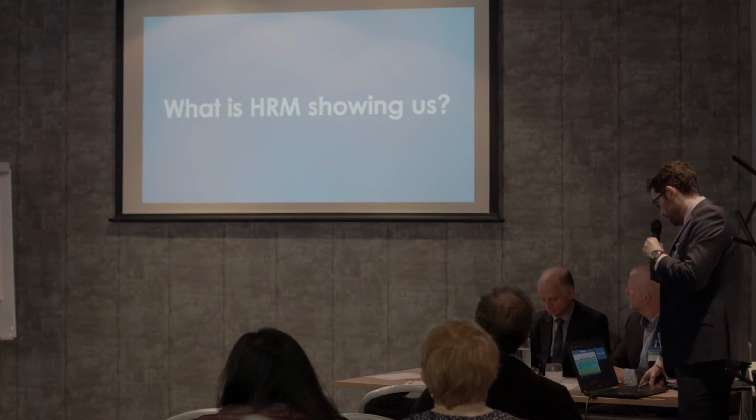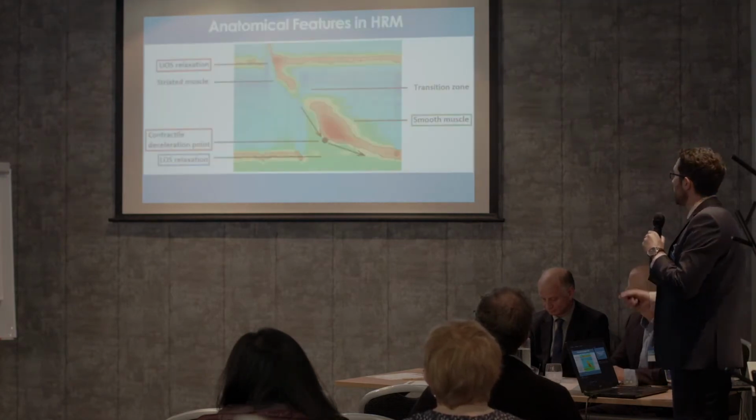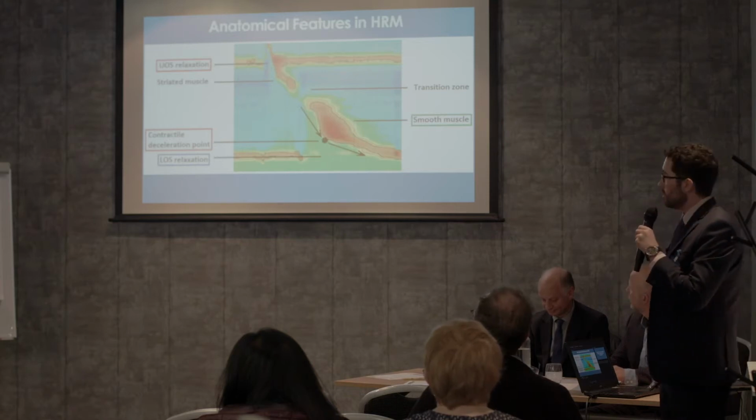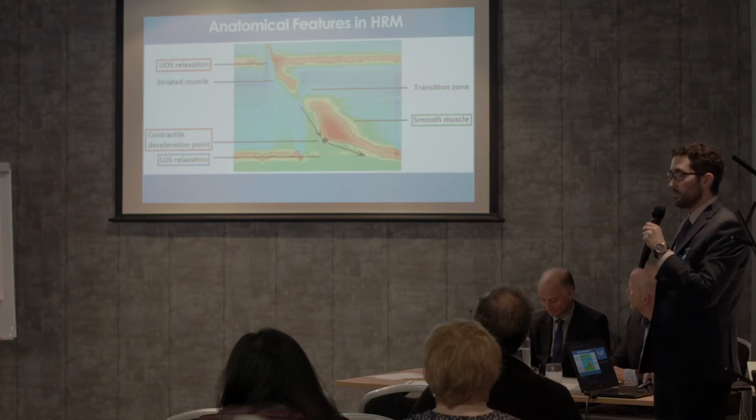So what is HRM showing us? Well, it is essentially just a pressure representation of the anatomy as it's working. So we can see the sphincters as they relax. We can see the esophageal body as it contracts.